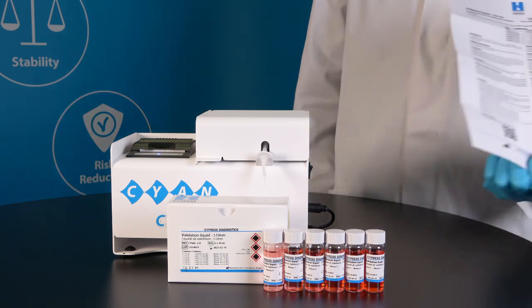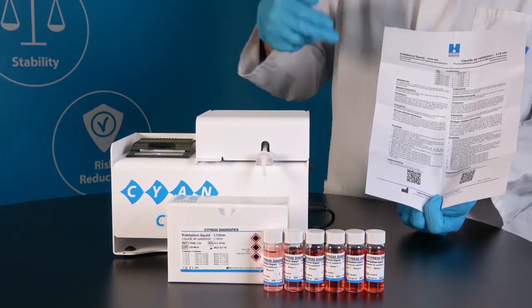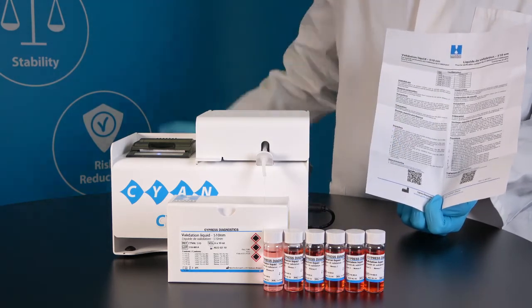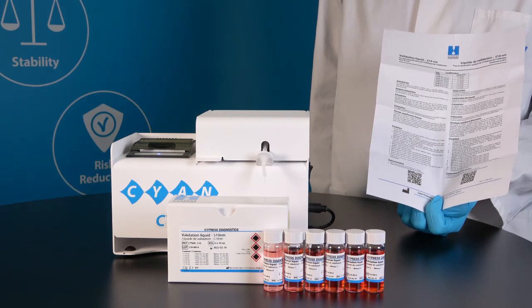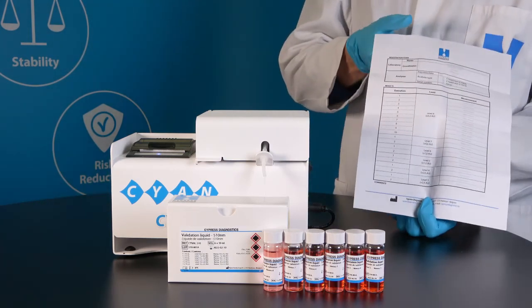Besides the liquid, each kit contains an instruction on how to perform the procedure, a QR code to the form to report the results, and a form to fill in the results at the back of the procedure.